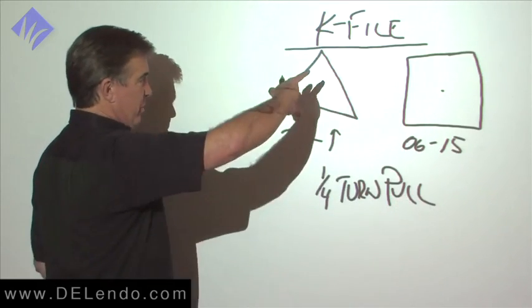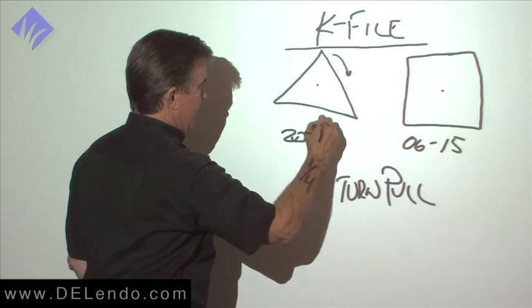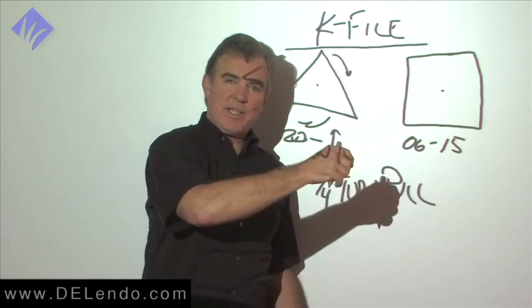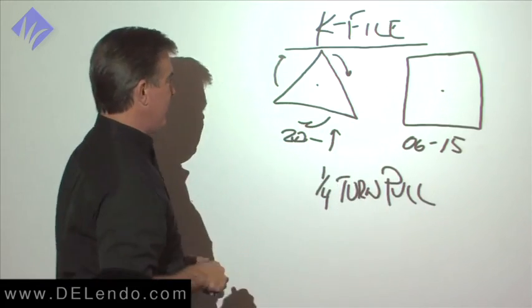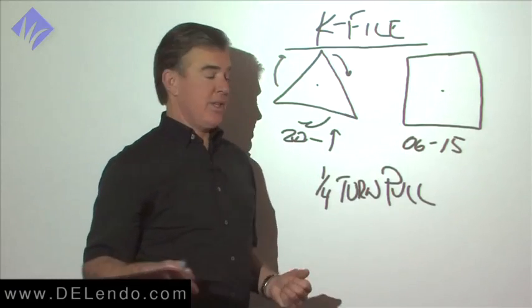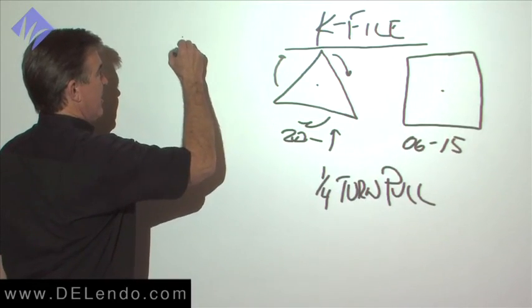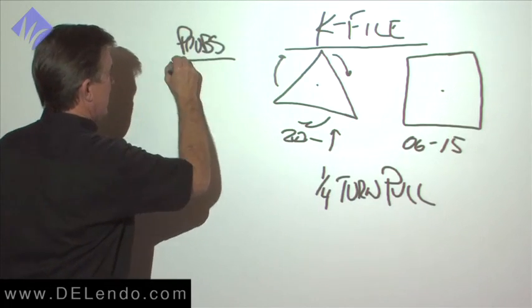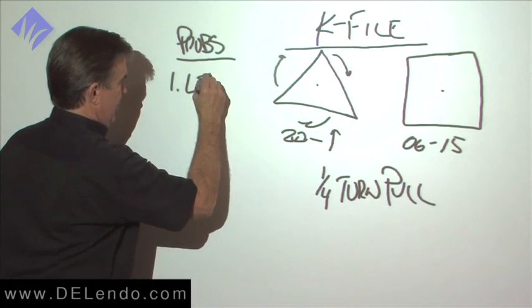And basically what we've been taught is to thread this file into the canal a quarter of a turn and then pull on it. So we thread the blades in and we pull, cutting that dentin that has been engaged by the flutes. A couple of problems with this, however. First off, is ledging. Huge.